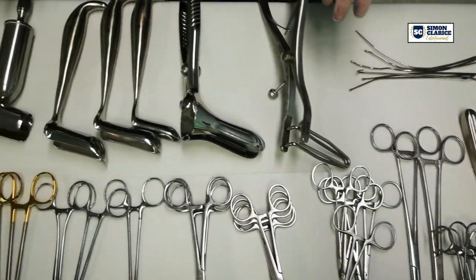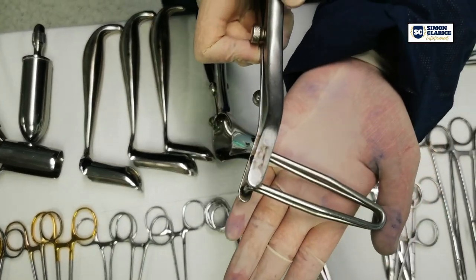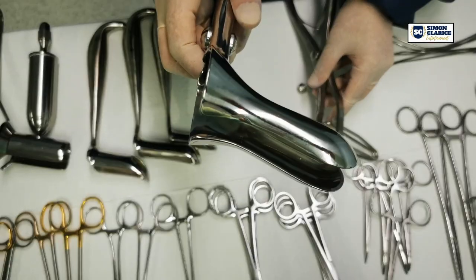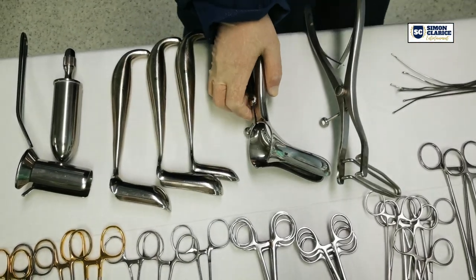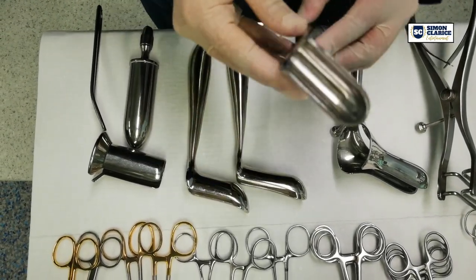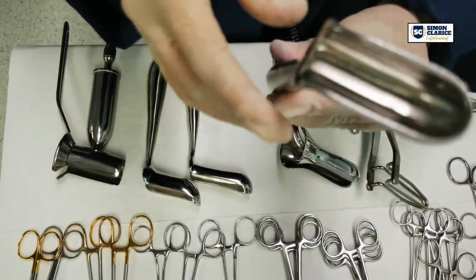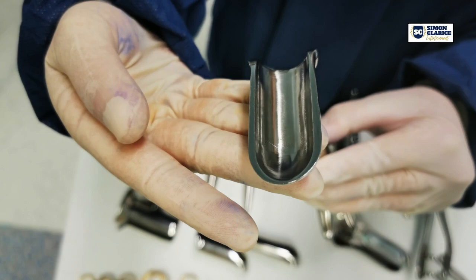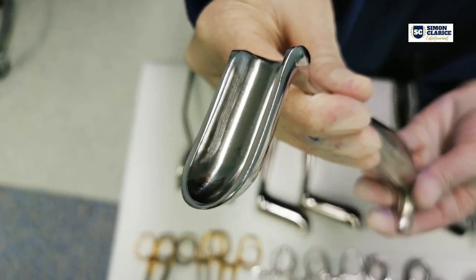And these are the different retractors on this set. This one is a SIMS retractor. And this is a Pratt speculum. These are the three different sizes of Hill Ferguson retractor. A Hill Ferguson retractor has a cylindrical handle and a curved blade at one of its ends. This retractor is primarily used to have better access on the lower rectum.